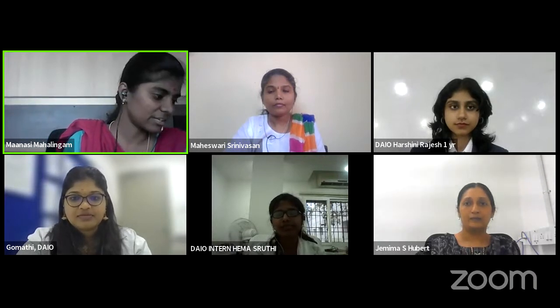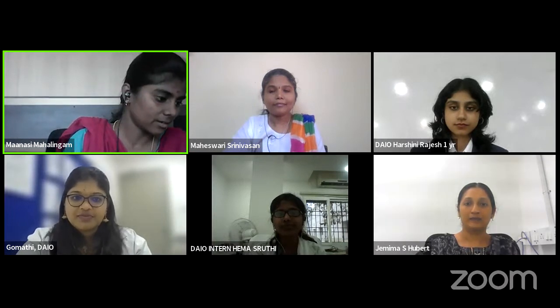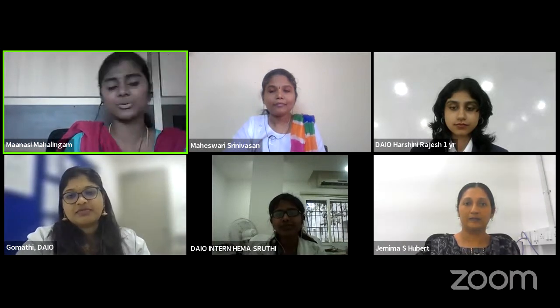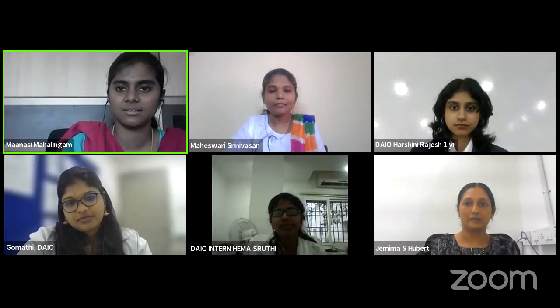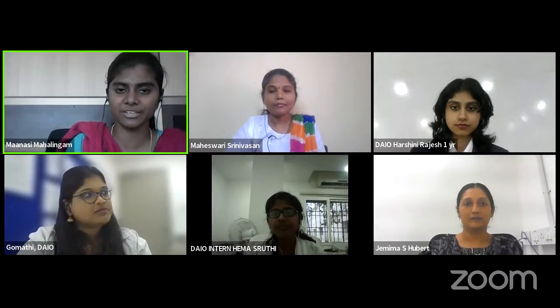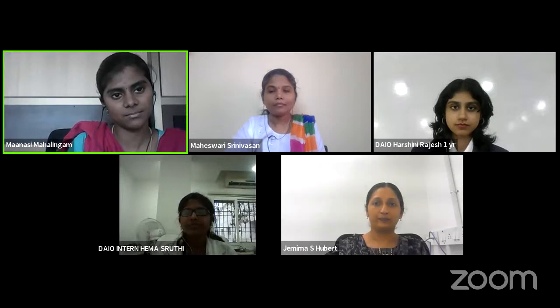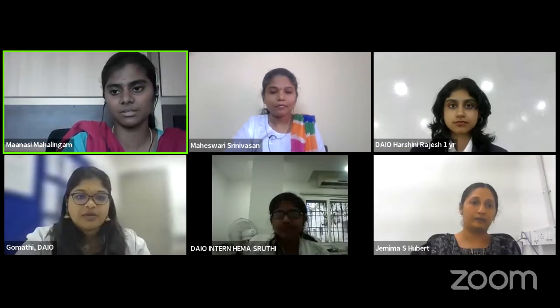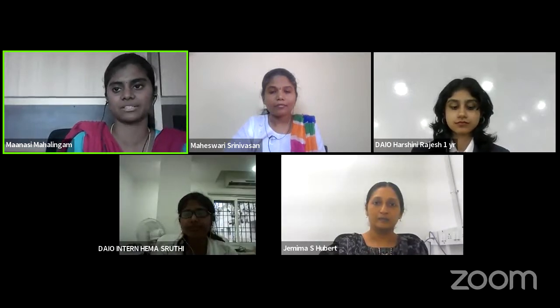And I have very few questions. You can try to answer, and if not, we will discuss. Do you have any idea about the hole forming factor? Macular hole. Do you have any idea on that? In macular hole, there is an index called HFF, which is called hole forming factor.